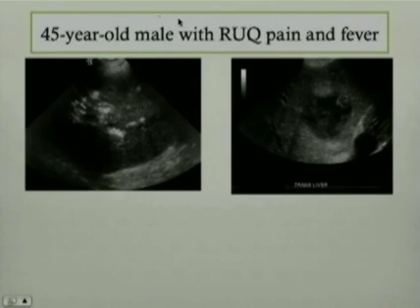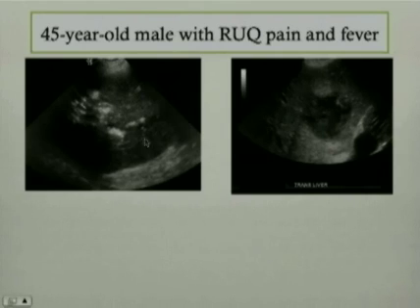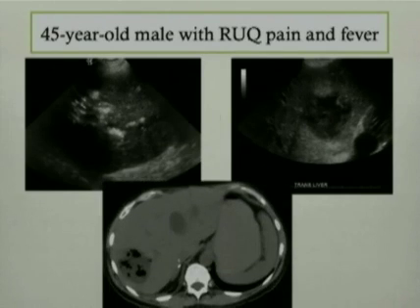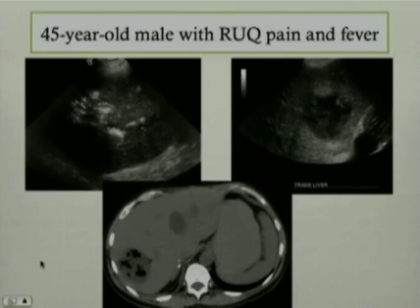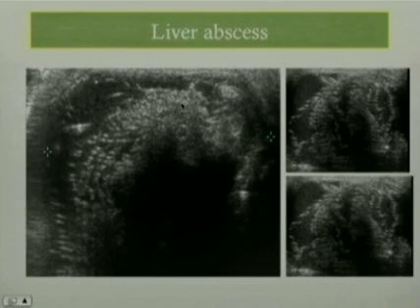Moving on to the next case — a 45-year-old male with right upper quadrant pain and fever. Two images from the liver demonstrate a very heterogeneous appearance of the liver and multiple echogenic foci with reverberation artifact. Another image from the same patient demonstrates a heterogeneous fluid collection with very irregular shaggy walls and some echogenic foci and reverberation artifact. This finding on ultrasound should raise suspicion for the presence of air within the liver, hence liver abscess. CT demonstrated a fluid collection in the right hepatic lobe with multiple foci of air, diagnostic of a liver abscess. Another example of liver abscess on ultrasound demonstrates echogenic foci occupying almost the entire right hepatic lobe with reverberation artifact.